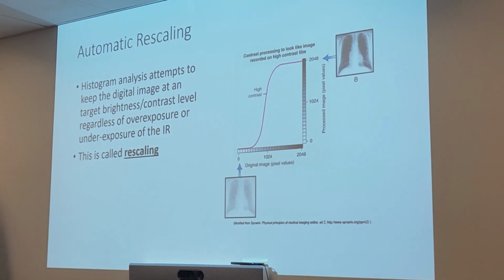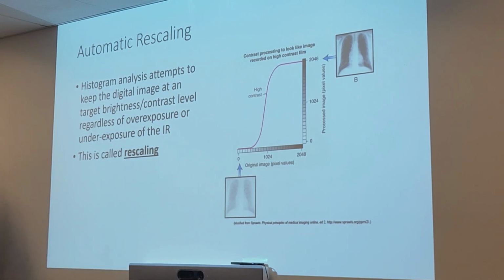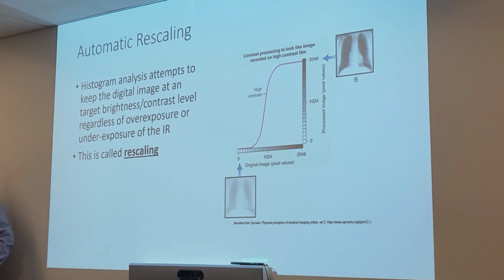Again. That's right. So we do it again. We repeat, right? Redo. So we are going to redo the grayscale automatically. Why do we need to redo the grayscale? In order to hit a target brightness and contrast. Okay. So the image that we start with.